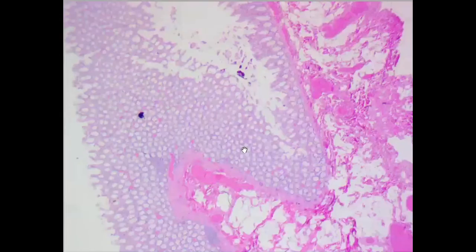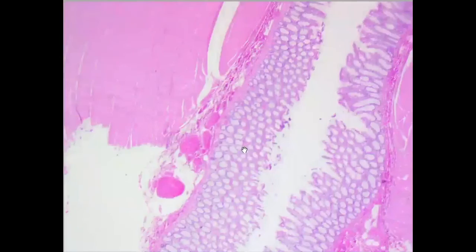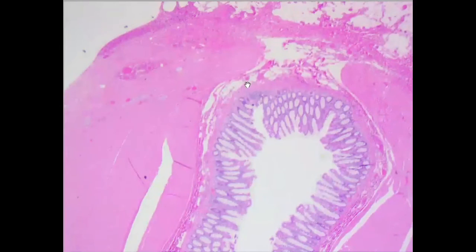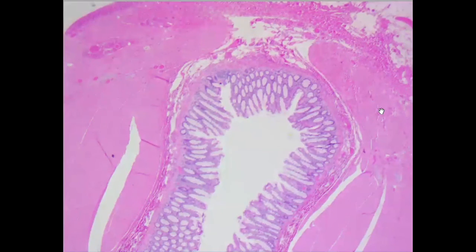This one, just to give you a good idea about this disease. So again, we have here the mucosa, and it will go deep. See, as if a tunnel is formed between two borders of muscularis propria, and it will go deep until almost here, where it penetrates into the muscularis propria. So this case was diagnosed as diverticular disease without diverticulitis, because sometimes we can see many inflammatory cells, and inflammation can happen on top of diverticular disease. And this is the serosa.